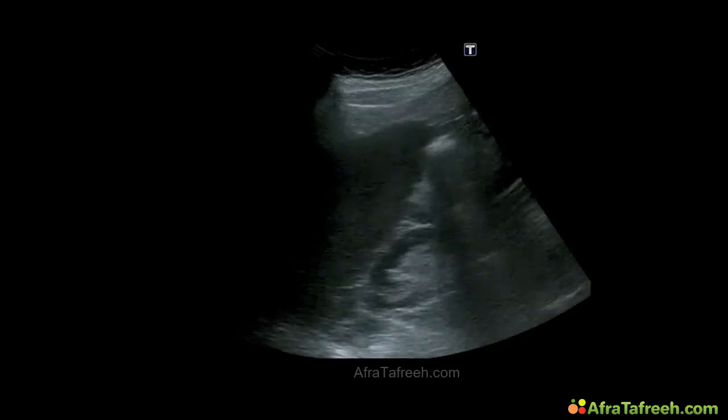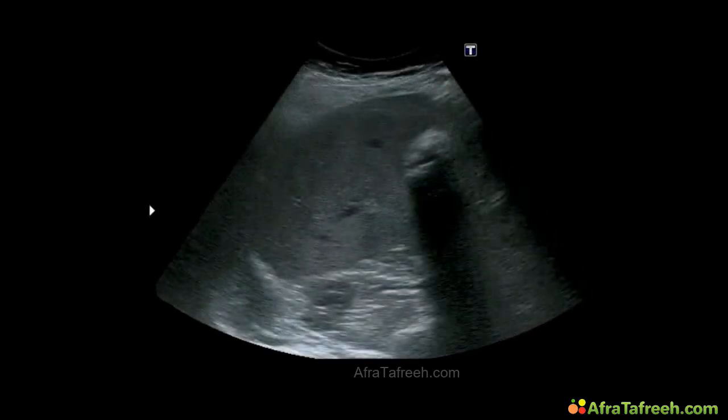With this patient who is suffering from pains in the right upper quadrant, we at first cannot guess what the problem is. So we go on scanning. And what's most likely to strike us is this acoustic shadowing over here. Where does it come from? Do you guess? When observing the shadow more closely, we notice that the source of this shadowing is the gallbladder, correct.